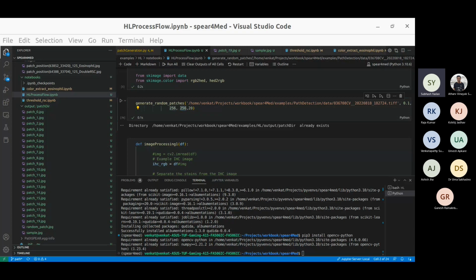In a recapture project we also had to shift back to 256 later on, because it was giving what we see under the microscope. So I'm just saying the function, whatever we make, should be applicable at different levels. It's not exactly at 1024, but it should function at all different patch levels. Okay.